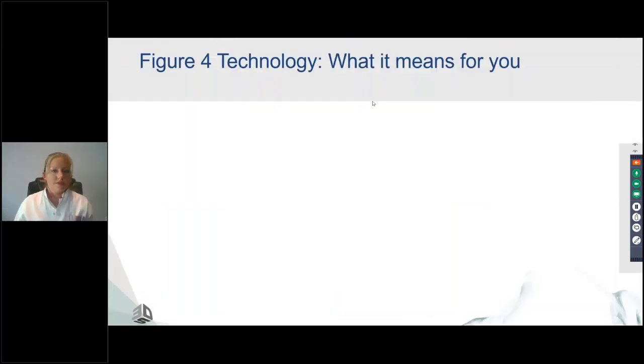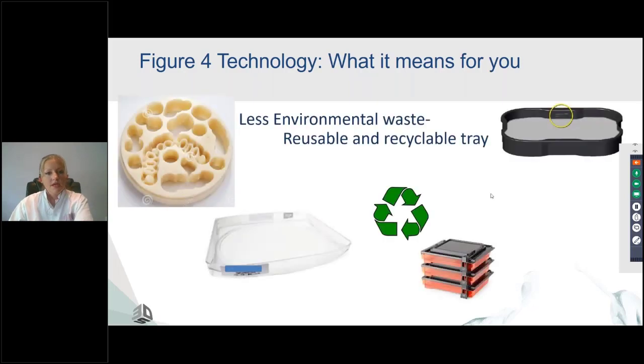So what is the difference between the NextDent printer? So this is what it means for you, the differences that you'll see with your visual eyes, the differences of the parts that you'll get out of our printer and the parts that you'll get out of others. Now I've used a lot of printers and these are the things that I've noticed. What I've noticed is that my resin tray never expires. I can use this tray for all of my materials for 1,200 prints.